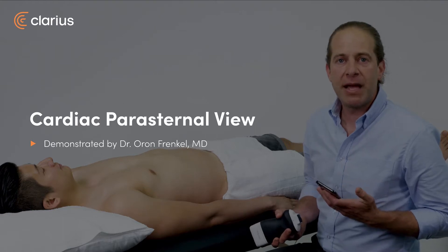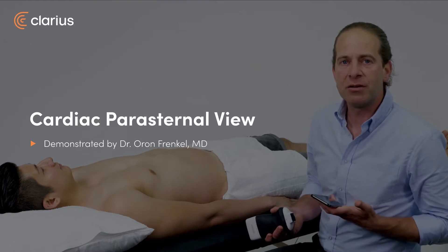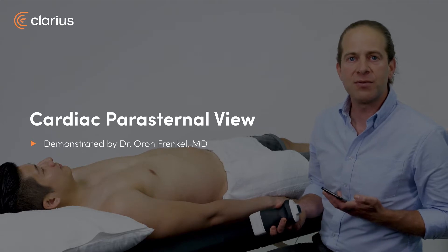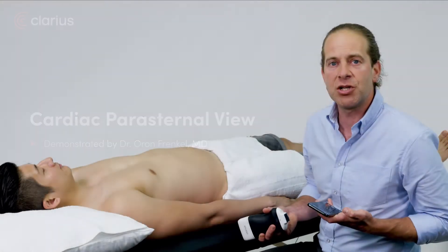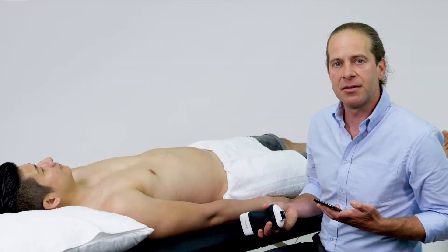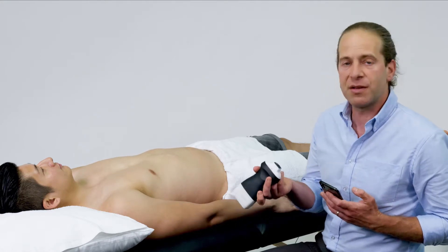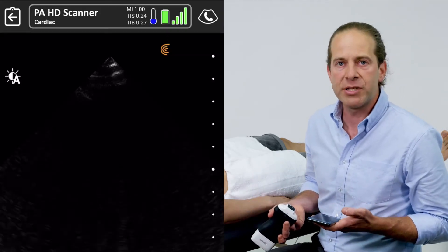In a patient presenting with chest pain, dyspnea, or hypotension, the parasternal long and short axis views of the heart can provide significant information about cardiac function at the bedside. To perform this scan, I'm going to use the phased array scanner on the cardiac preset.